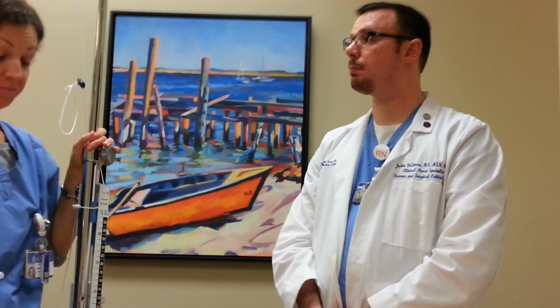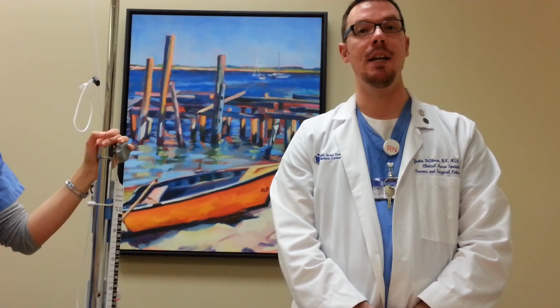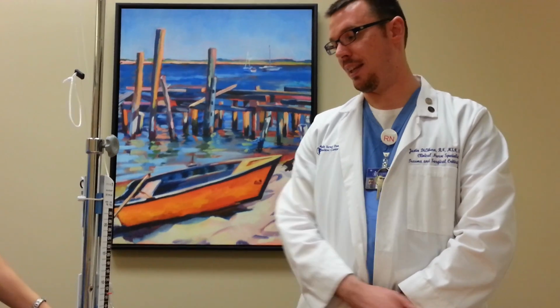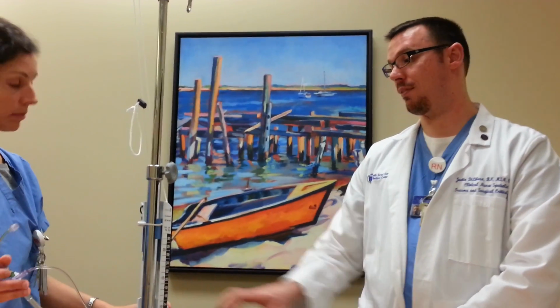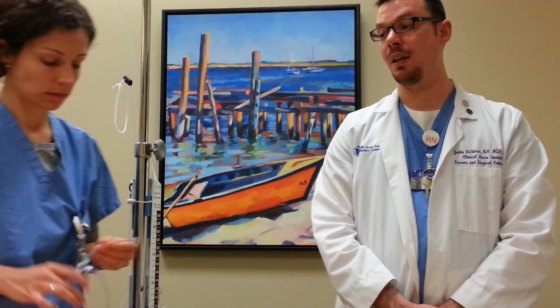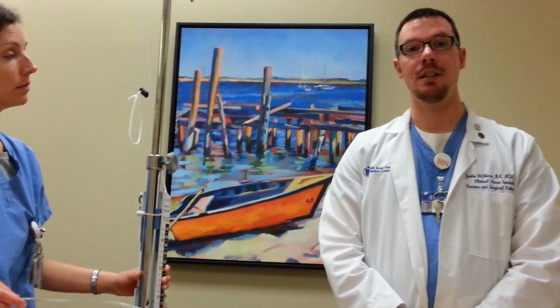What am I missing? Oh, also inadvertent access for drawing samples. So providers have inadvertently accessed it thinking that it was an A line. Obviously, this looks very different than an A line, but if you have the transducer maybe even separated off of the ventriculostomy device, it can look very much like any other transducer. So best practice, again, always follow the lines to the source of origin, but then label EVDs clearly.